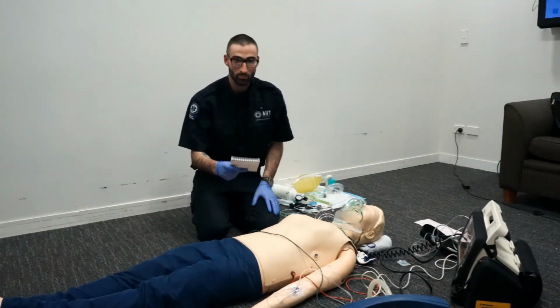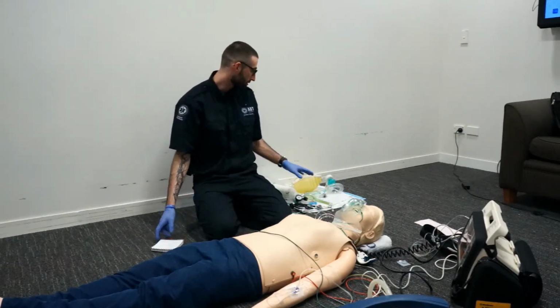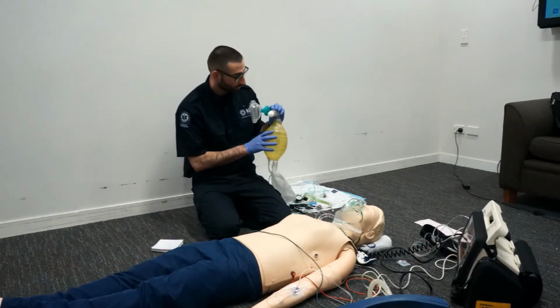Prepare a manual ventilation bag with PEEP valve attached if not already in use. Okay, it's not already in use, but we do have it on the side here ready to go, the oxygen tubing, and our PEEP set to 5 centimeters of water.